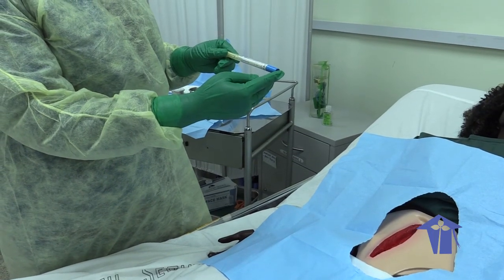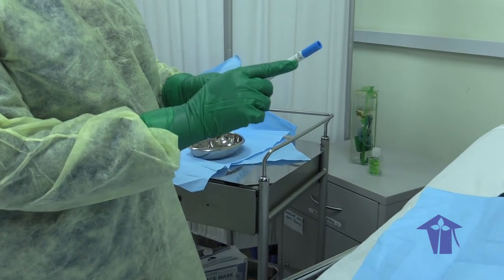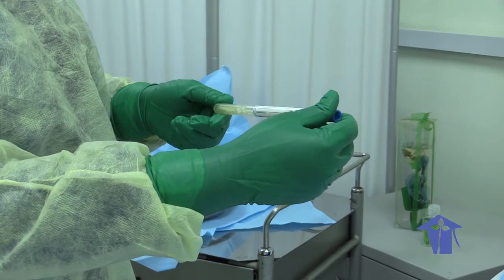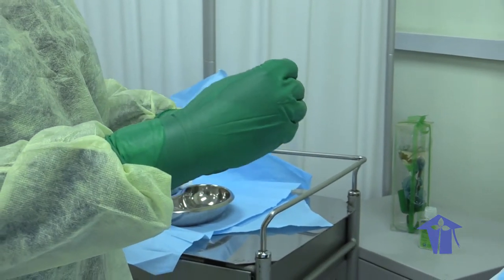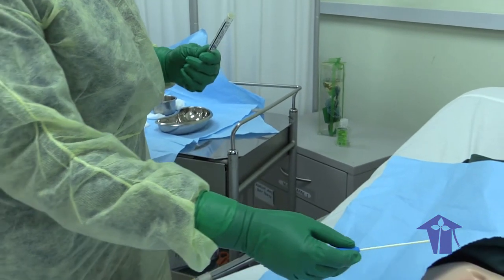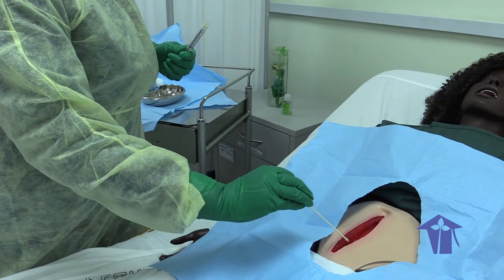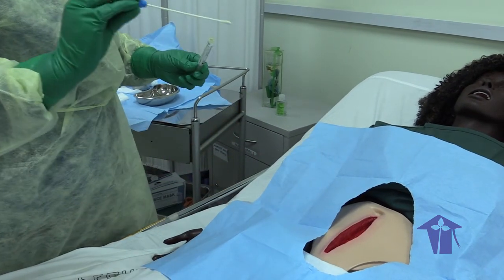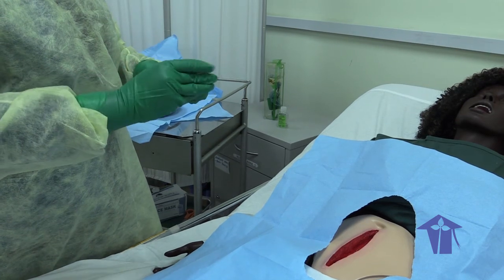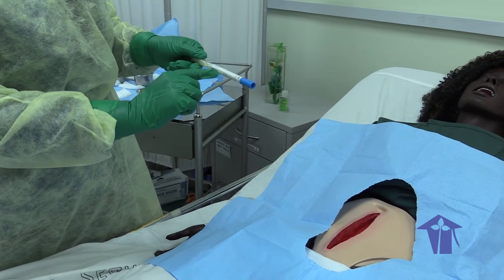obtaining a wound swab. Check the expiry date and the integrity of the container. Remove the swab. Apply the swab stick to the center of the wound, moving it all the way down. Once a sample has been obtained, replace the swab stick into its container. Fill in the required information.